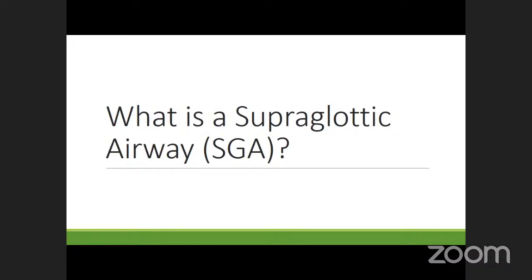So what is a supraglottic airway? Specifically, LMA, Laryngeal Mask Airway, is a brand. From now on, because most of the literature uses the term supraglottic airway or extraglottic device, you will hear me say SGA. Since the brand we use here is the Laryngeal Mask Airway, when I say SGA, just assume it's LMA. But the data, the literature, all usually just keep it vague. They purposely try not to use the brand names.